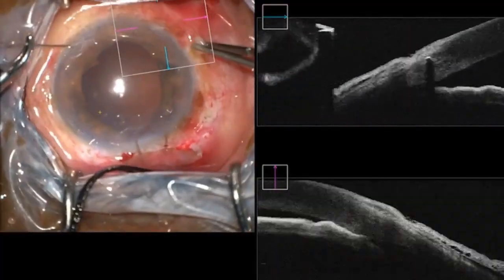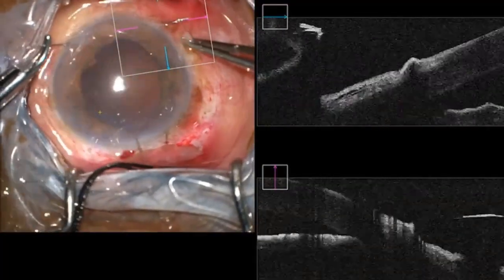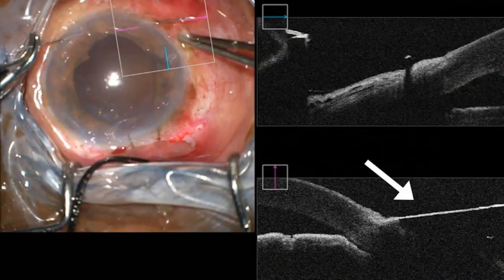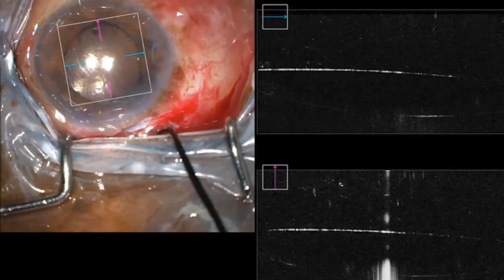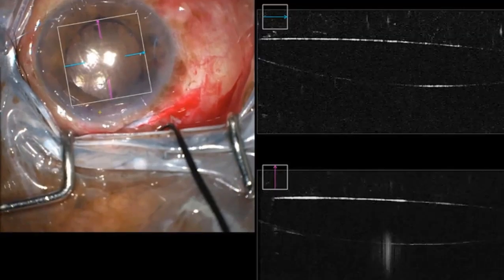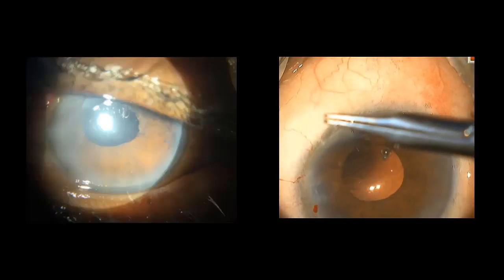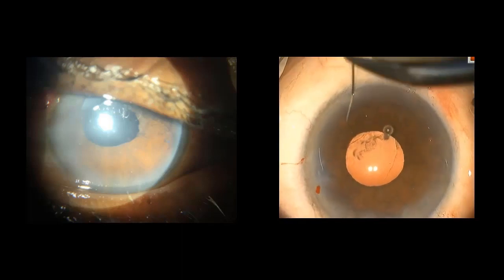This is an intraoperative OCT of the single haptic fixation of the intraocular lens, which shows that the needle is passed through the limbus and comes out of the limbus. Finally, we can observe that there is no lens tilt or decentration with this technique. The single haptic fixation of the intraocular lens is initially challenging but a very attainable skill.